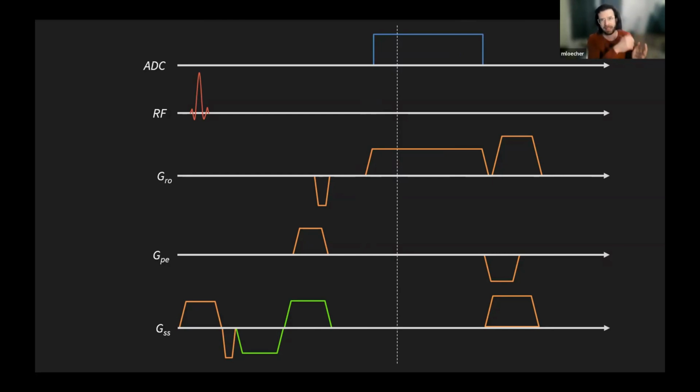So we should still have the exact same response, because while all these other gradients are creating their own eddy currents and things, we've found from testing and theoretically that because those gradients all stay constant during the TRs, they end up reaching some steady state and all getting canceled out by that phase subtraction step. So really all we are going to care about is what's happening due to the bipolar gradients.